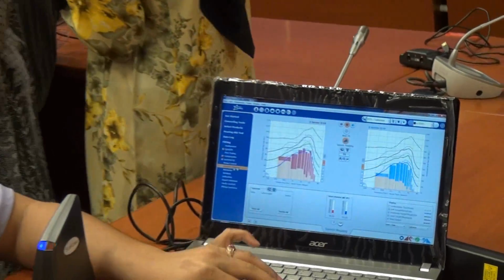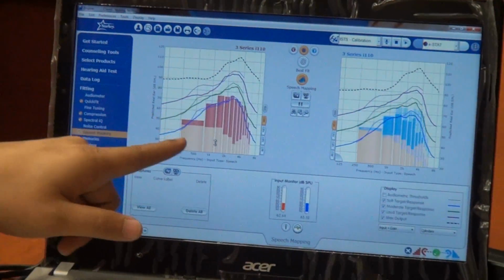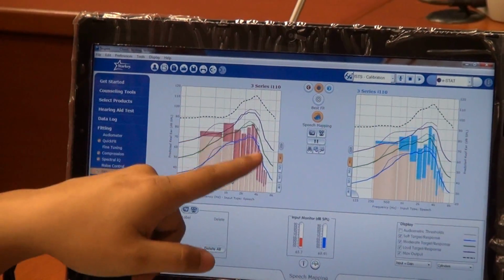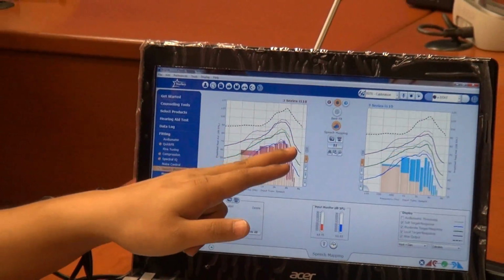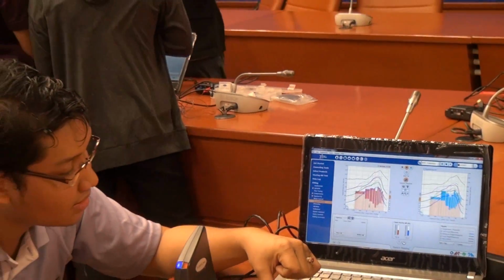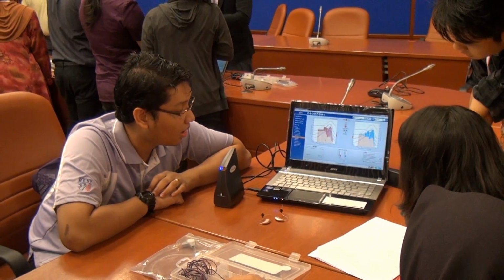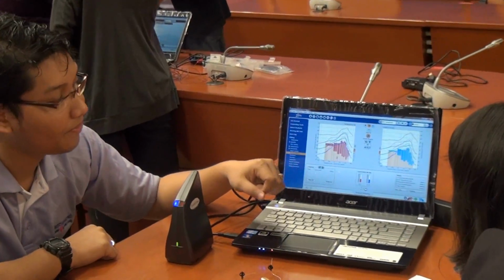So, okay, this is the speech mapping. The yellow bar is the input, the red bar is the gain, and the overall is the output. So it must touch the green line. So it will show the high frequency is responding. So we say it again to show the low frequency.